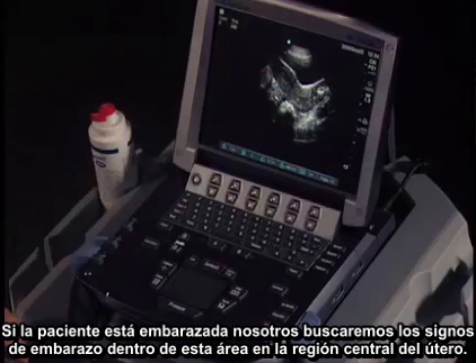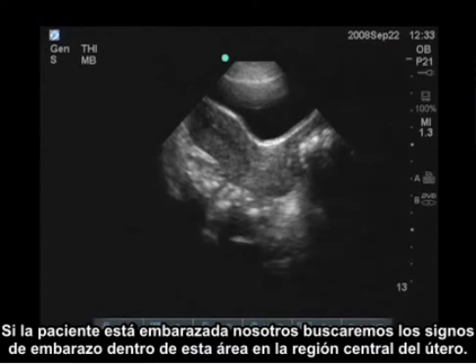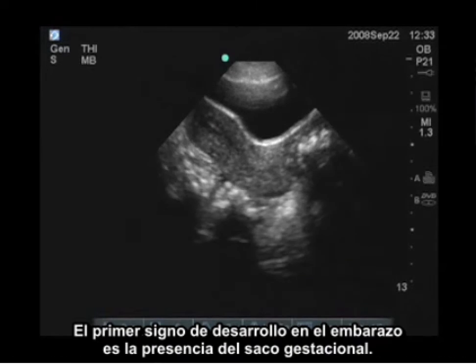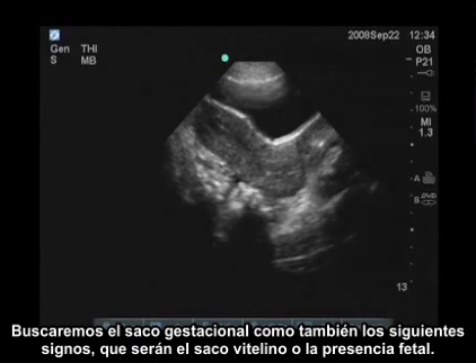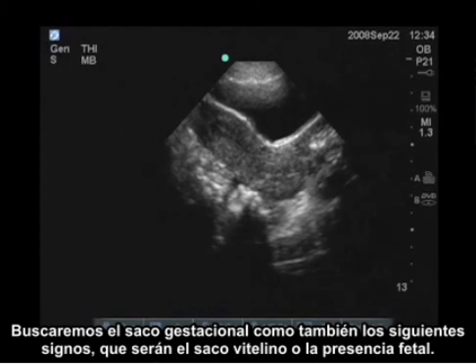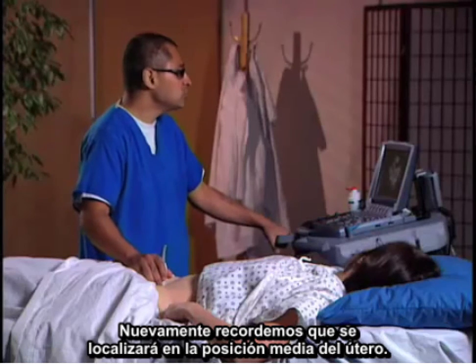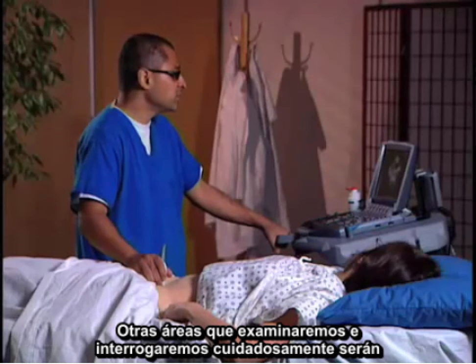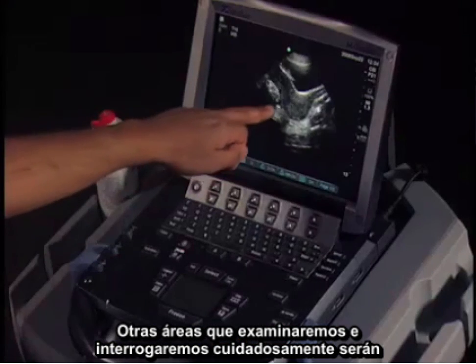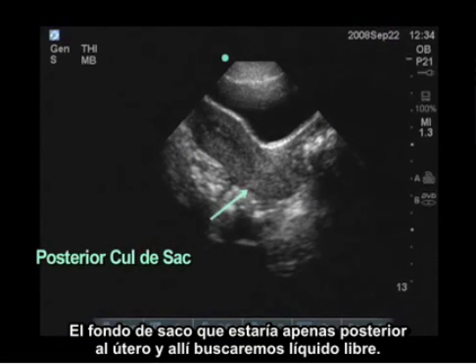If the patient was pregnant, we would be looking for signs of pregnancy within this area, within the mid-uterus. The first sign of a developing pregnancy is a gestational sac. We're going to look for a gestational sac, as well as the next subsequent signs, which would be a yolk sac or a fetal pole. Again, these would be located in the mid-uterine position. Other areas that we're going to be carefully examining and interrogating would be the cul-de-sac, which would be just posterior to the uterus, and there we're going to look for free fluid.